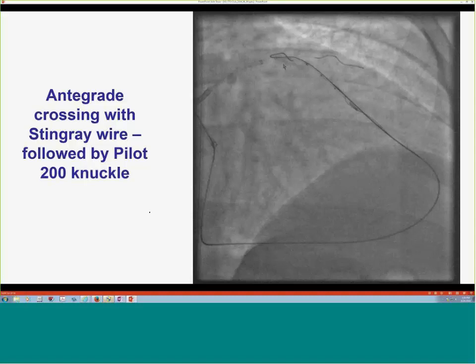Those markers that you have there, I think this is the IVUS. Oh, you still have the IVUS down there. Yeah, we crossed antegrade, and then we did an IVUS just to see exactly what we're dealing with in that part. So these are the IVUS markers, the Eagle Eye and IVUS catheters over there. I see. So you did a reverse CART, but the two wires met in the mid LAD instead of the proximal LAD or left main.